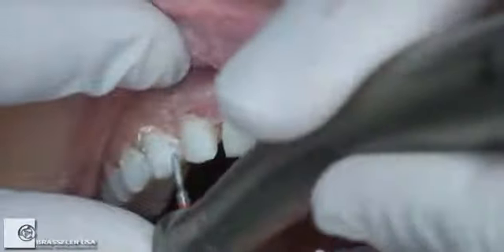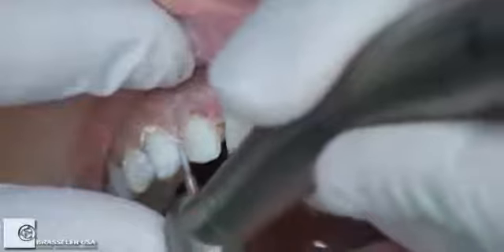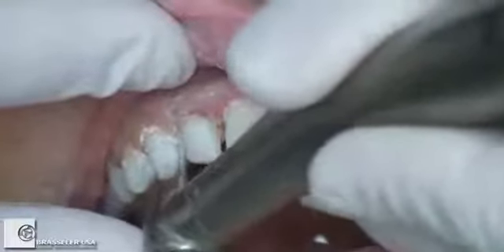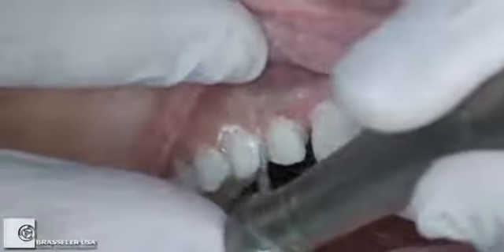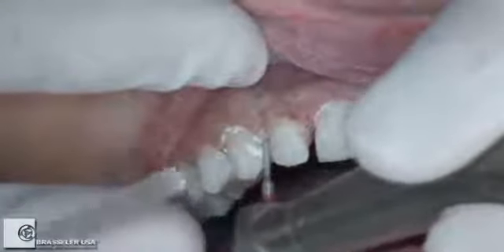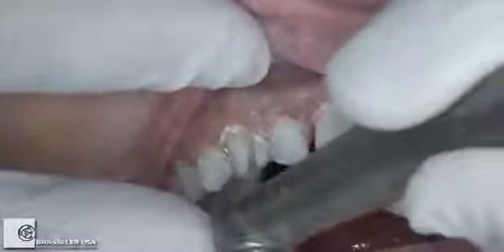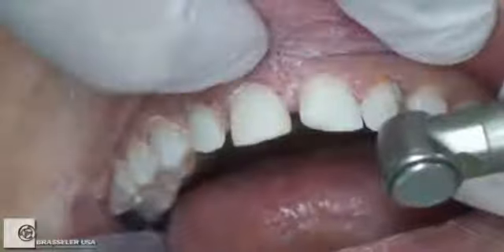And at the facial incisal edge, like I talked about in the lecture, I like to have a rounded facial incisal line angle. And what you just saw me do previously a few seconds ago was just round that facial incisal line angle. We'll smooth that a little bit later with a disc. I'm going into that so-called elbow region, the gingival proximal region, to hide the margin in there a little bit. There was a little discoloration on the canine, and so I'm just prepping just a little bit in that region, again without packing cord at this point.